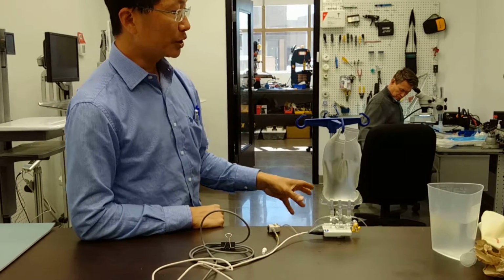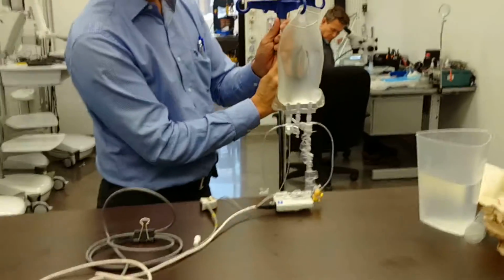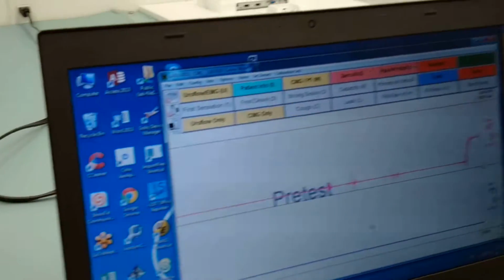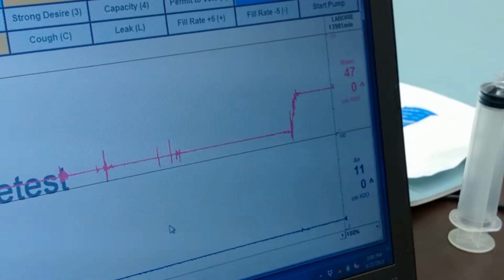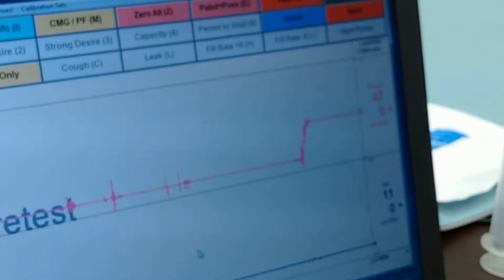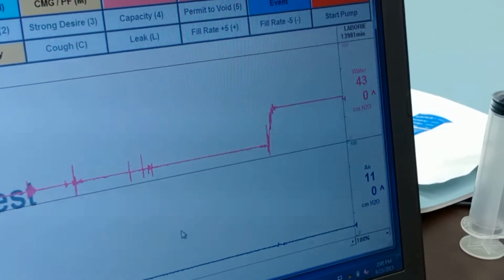So in this particular situation, we're going to ask the patient to stand up. When the patient stands up, something like this, you will see that the water just shot up to 47, and that the air stayed at 11, because we showed in the previous demonstration, air is not impacted by patient position. So where would you put the water transducer height? Simply, you would raise this.